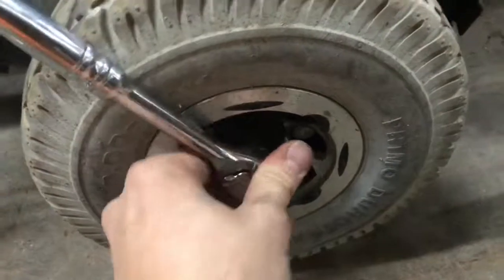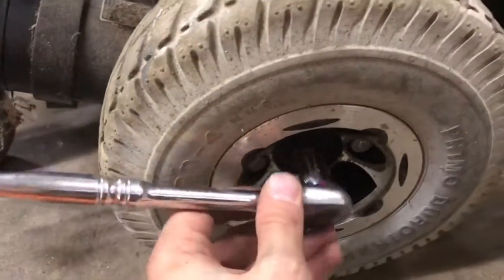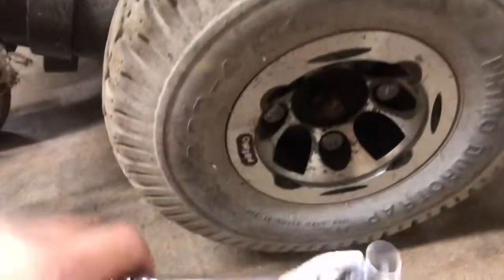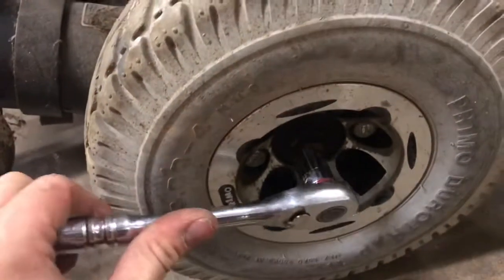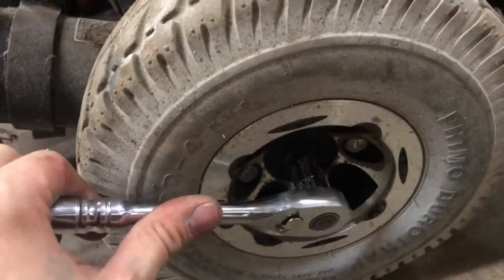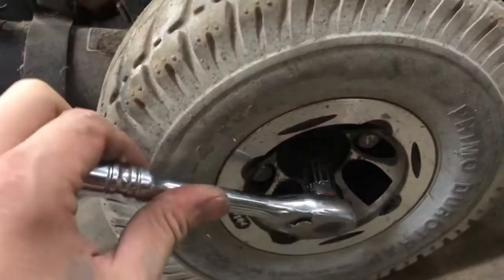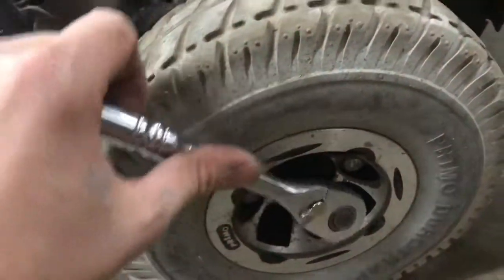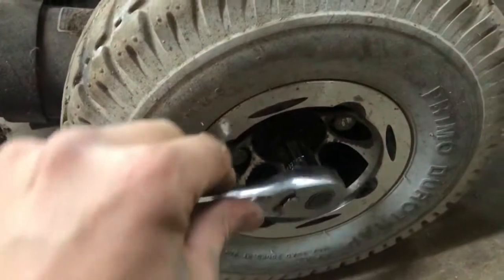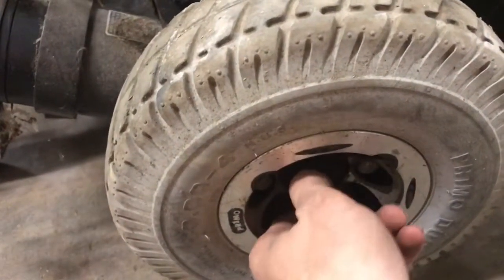Another thing you wanna make sure to do, which I will say again in the video, is buy some blue removable thread lock. You really wanna put some on the screw. Obviously somebody has taken this off before, and it really shouldn't have been this loose. Probably because they didn't put the blue removable Loctite, and it was partially backed out a little bit. So especially on your wheelchair, which is going over a lot of vibration and bumps, you definitely wanna put some on this screw, and on the Allen screws when you put them in, so you don't accidentally back those screws out. Otherwise, when you're riding your chair, the motor will just fall off. Or you'll probably break the gearbox, which is probably what would happen, and you'd have to buy a new gearbox or a new cover.